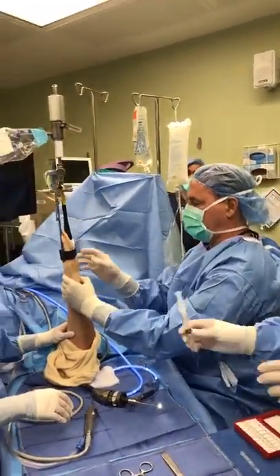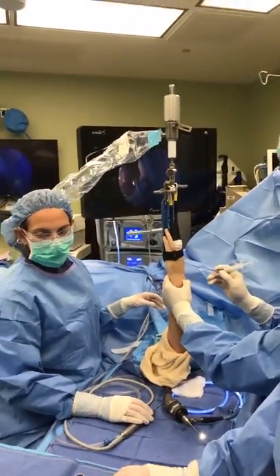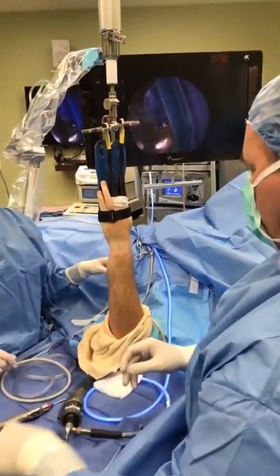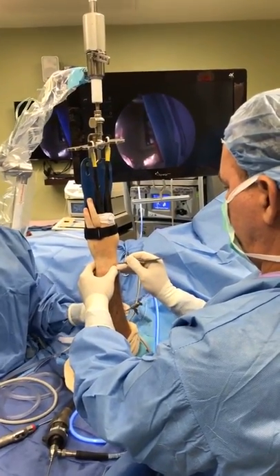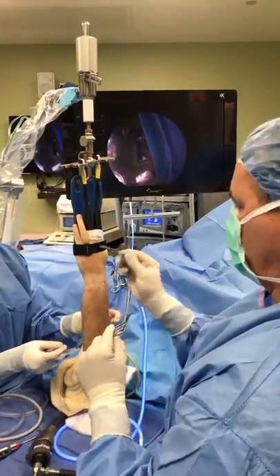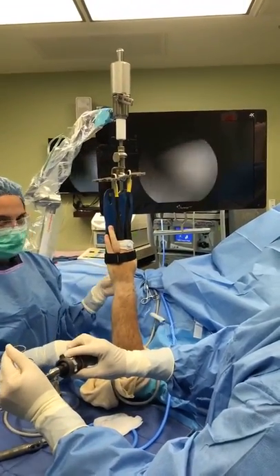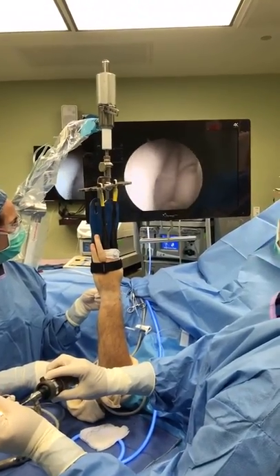So what we're gonna do today with wrist arthroscopy, we're gonna look. So we're gonna put some fluid in the wrist. Let me just make a tiny little hole, okay? All right, and we're gonna go in with this trocar and use the camera. So if you look on the monitor, there's my glove. I'm gonna fool Kate into thinking, look at that big tear, Kate.